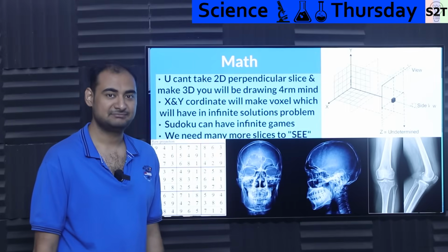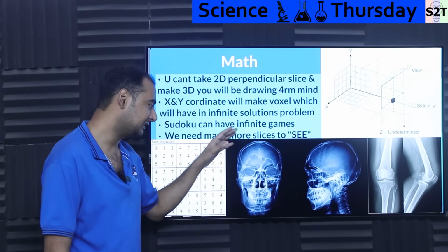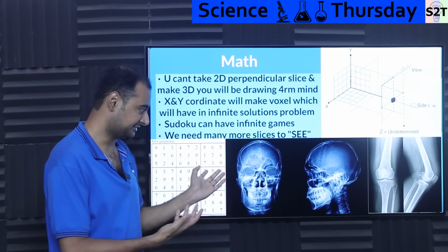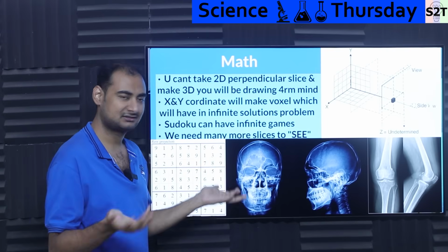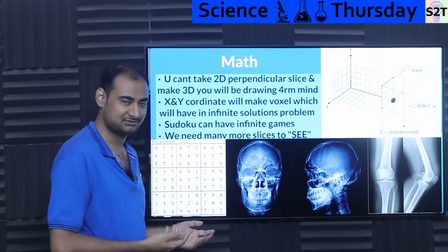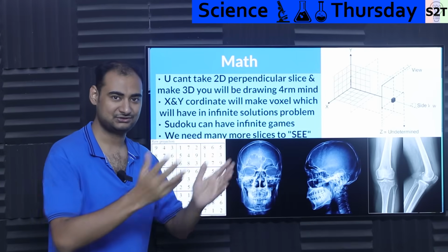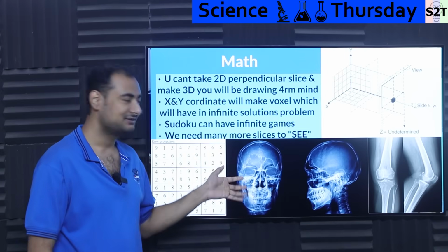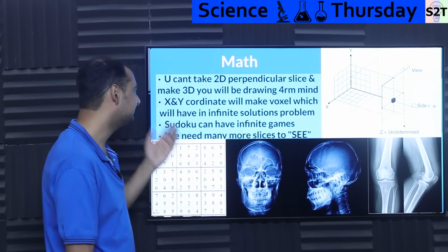First you have to understand the mathematical problem. If you show anyone the side profile and front profile, an artist can give you an almost accurate, realistic-looking skull. I used to do that. That was our job. We did not get an X-ray of the car; we were just given the front view and side view, and we modeled it. But you can't get mathematics done from it. Why not? Because the data is not there.